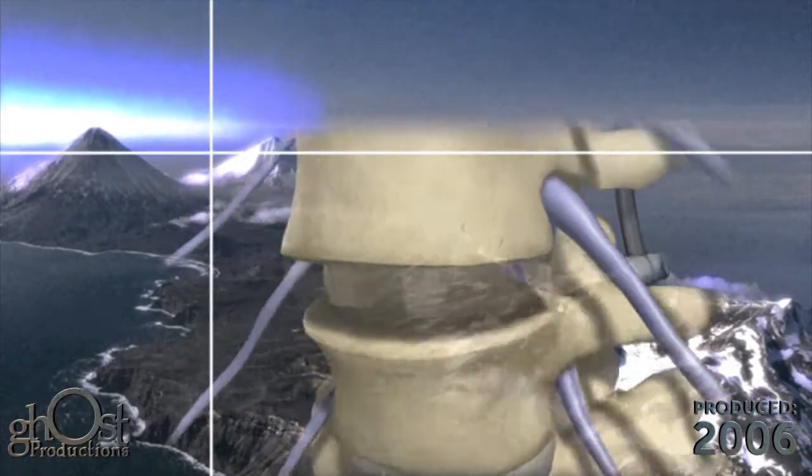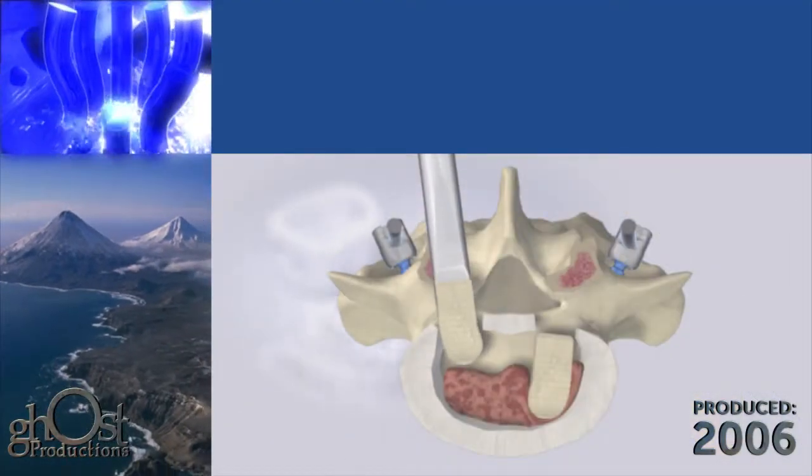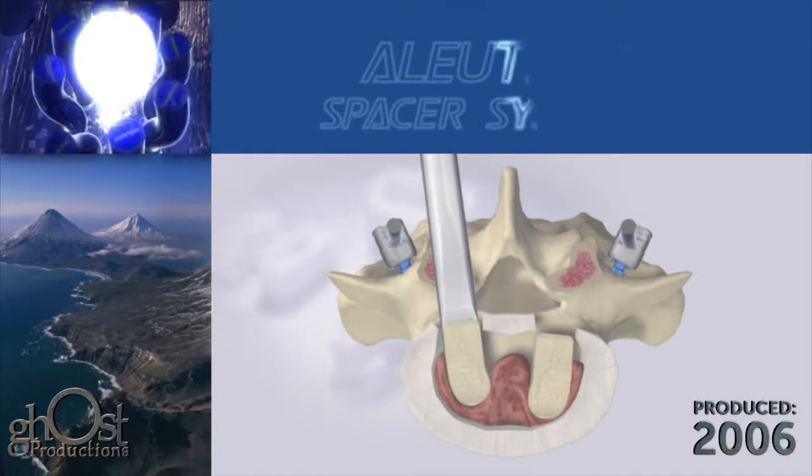Introducing the Aleutian Spacer System from K2M, surgeon-driven design.